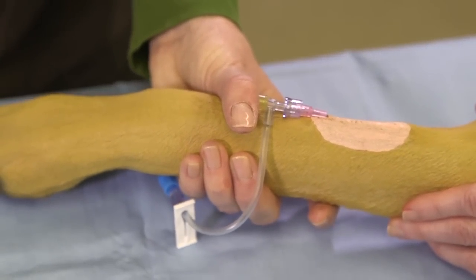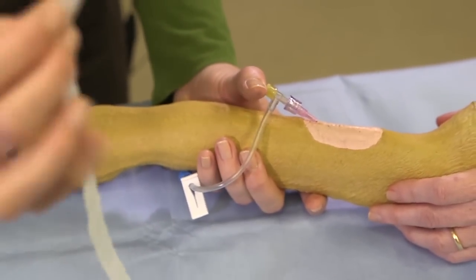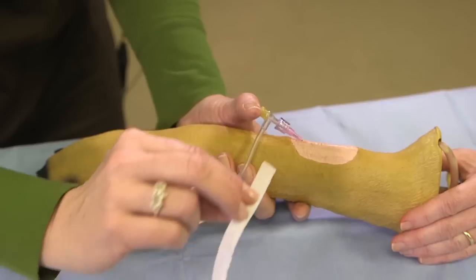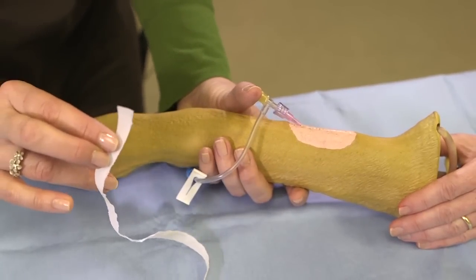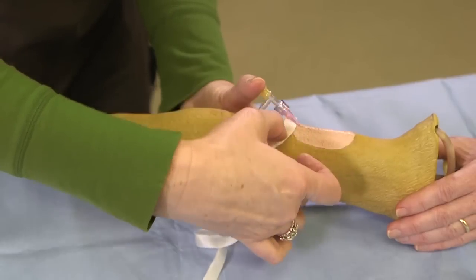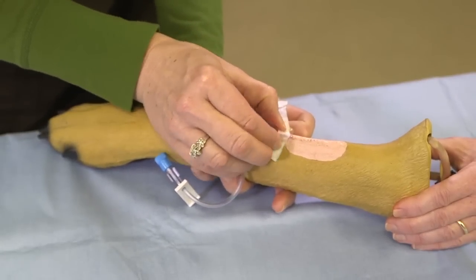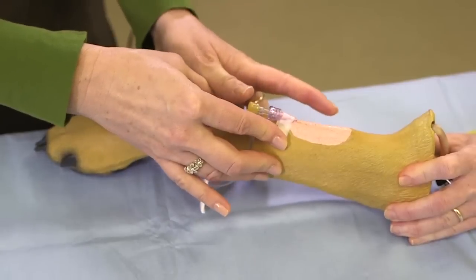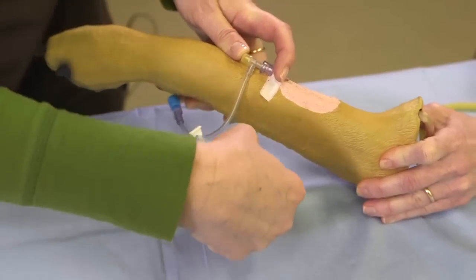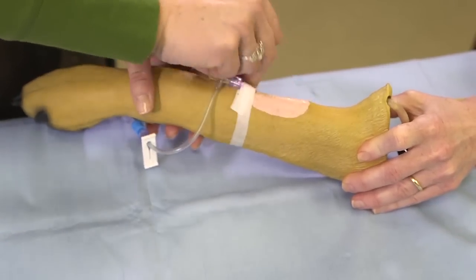Next is taping. There are many ways to tape in a catheter — I'm going to show you what I do. I take my piece of tape; you want it to be a length so that it can go around one and a half times. I have ripped mine in half. You can use your thumb to lift up the catheter, go under your catheter sticky side up, and then bring this around. Make a little wing — get it nice and secure around that catheter. This piece of tape is actually the one that's really holding in your catheter. Bring it around again, coming up and around over your catheter and onto itself.